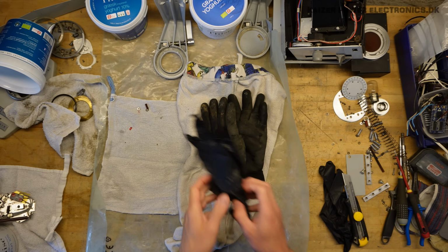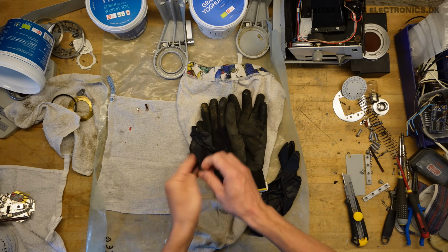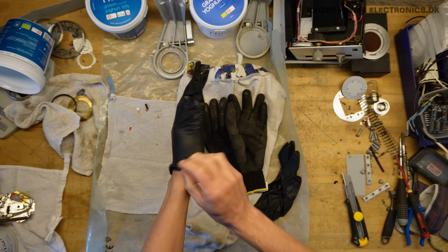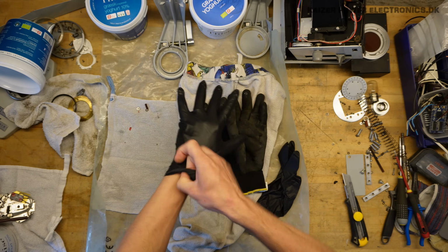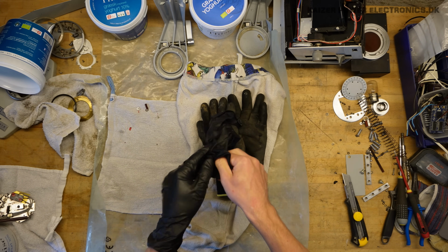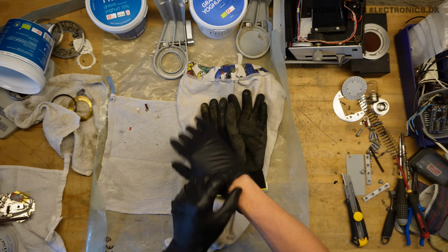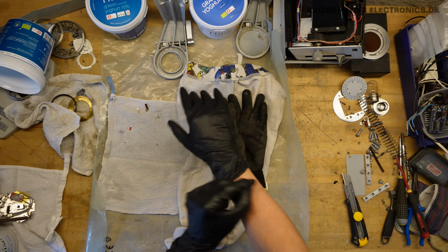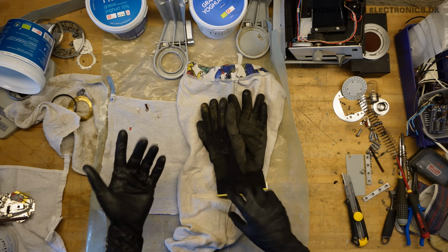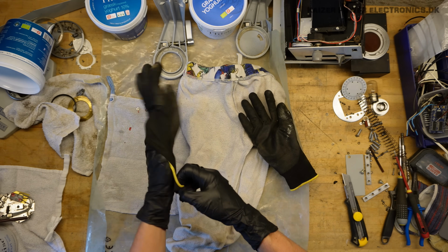Transformer has been sitting upside down for a couple of hours now. I did a quick PCB test, and that is simply by taking a small bag of water and then dropping a few drops of the oil into it. And if the oil floats, then it is not a PCB containing oil, as PCB oils are heavier than water. Now that test can only tell you if there is PCB present, it cannot tell you the concentration.